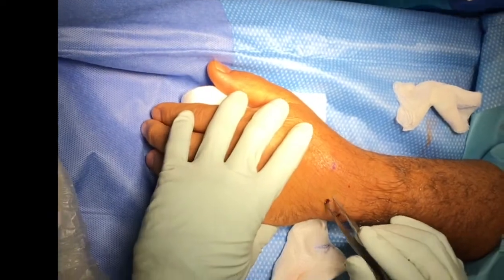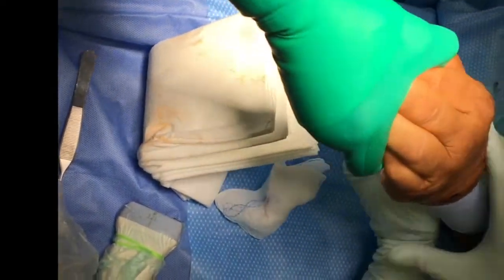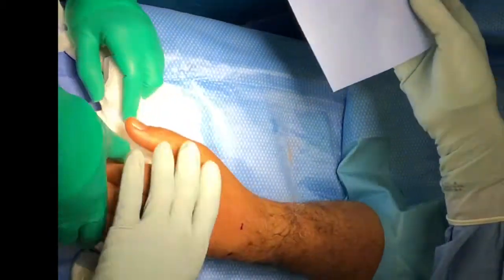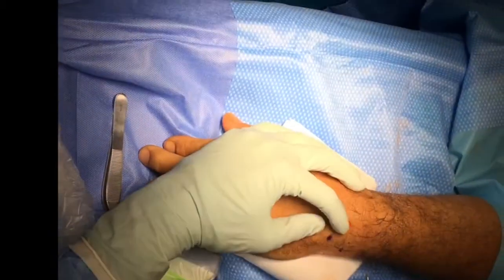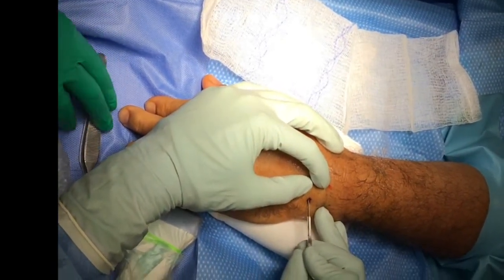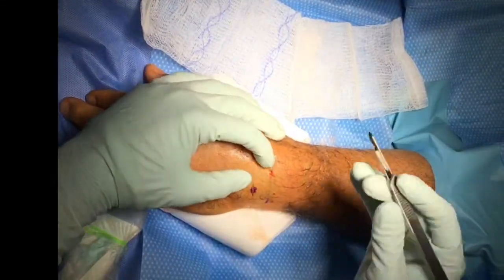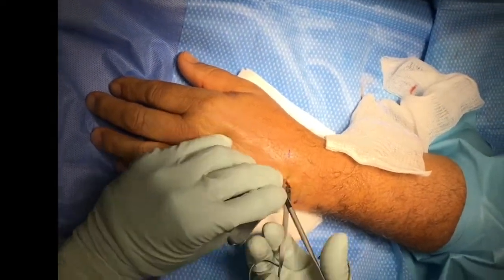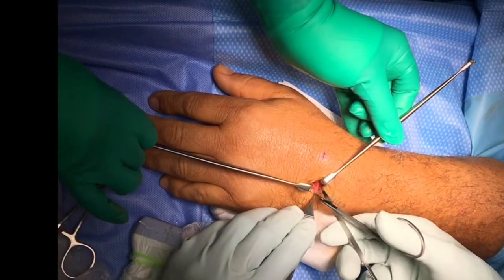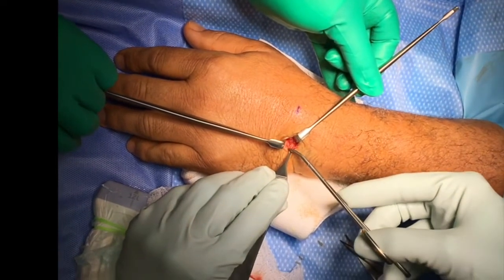Once we've identified the foreign body, we exsanguinate the forearm and raise the tourniquet so that we can control bleeding. This exsanguination is performed using something called an esmark, which is a rubberized bandage that allows you to stretch and compress the tissue. We then make a small incision over one end of the foreign body and dissect very slowly and carefully down to the foreign body using tenotomy scissors. You can see us carefully dissecting down to the foreign body, trying to identify it as we go, and once identified, we used a special forceps to grasp the foreign body and remove it.